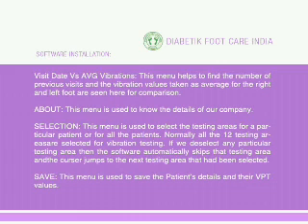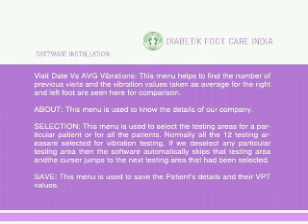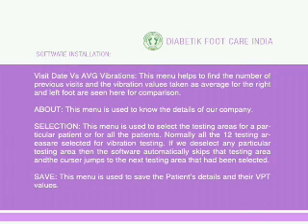Selection: This menu is used to select the testing areas for a particular patient or for all patients. Normally, all 12 testing areas are selected for vibration testing. If a particular testing area is deselected, the software automatically skips it and the cursor jumps to the next selected area. Save — this menu is used to save the patient details and their VPT values.